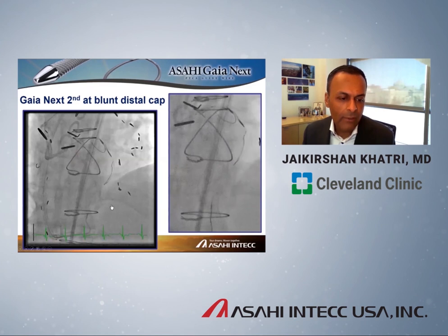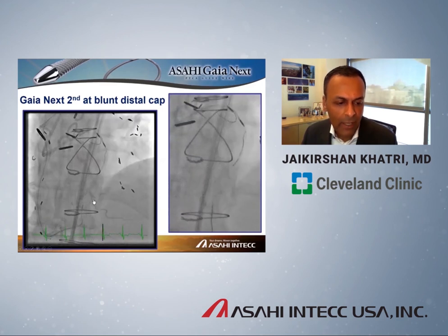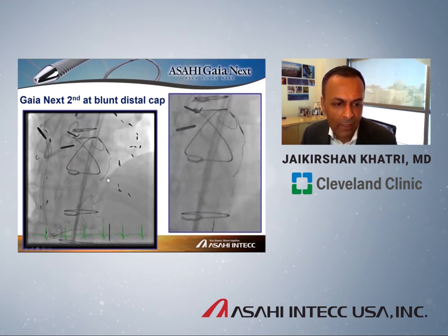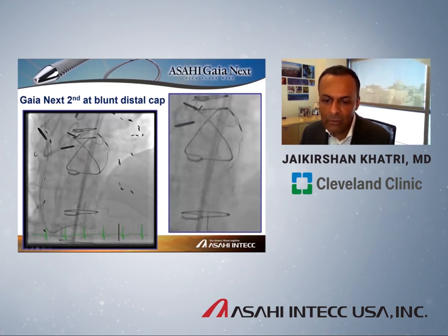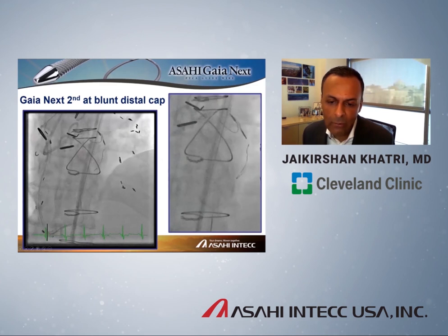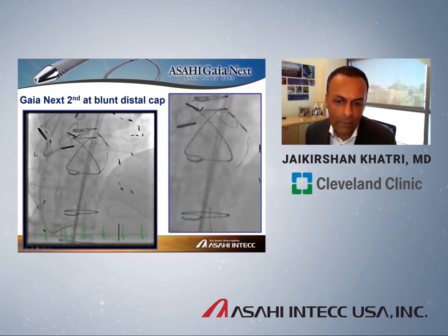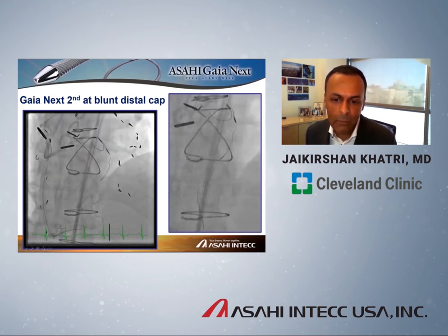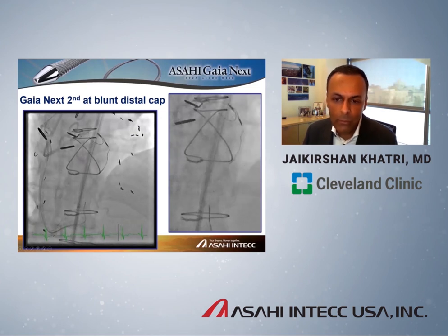Here is a real-world example: a CTO done retrograde through a vein graft. You can see a microcatheter at the distal cap, which is quite blunt with side branches nearby. The goal is to achieve a reverse CART at the antegrade knuckle. We used a Gaia Next second wire — initially the wire goes the wrong way, but using the nose cone and torque response, we reengage the cap and advance the wire toward the antegrade system. Whereas in the past I might have used a stiff penetrating wire plus a polymer jacketed wire, now I can do all of this with one guidewire.